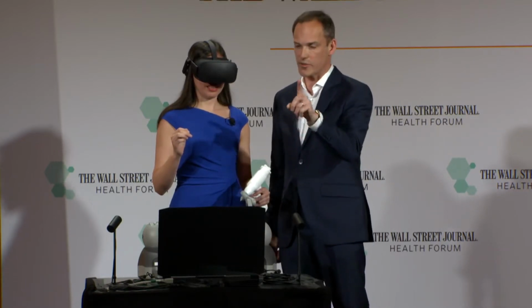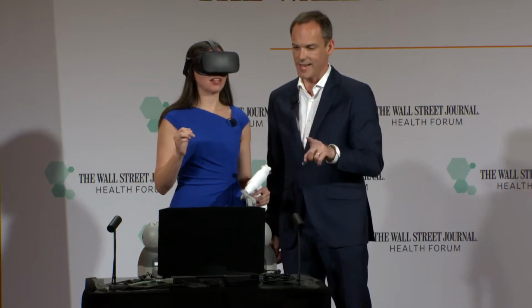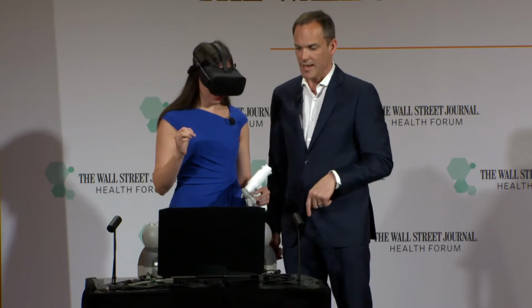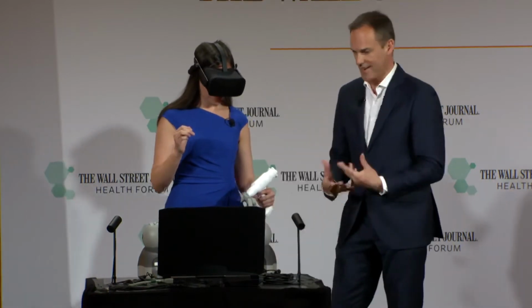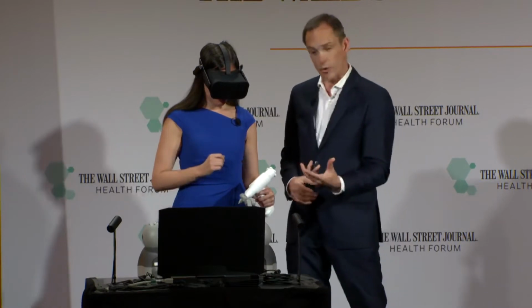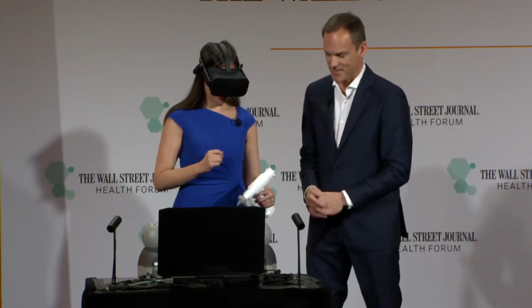So if you perhaps look up to the top left of the screen, and there's an eye there. Click on that. And now look down to the patient. And we've now given you a little virtual overlay, a hologram. Exactly. So a little additional instruction. So self-proctoring. You don't necessarily need an expert there to explain how to work. And then please feel free to go for it.